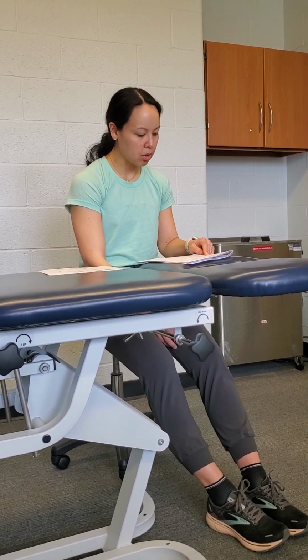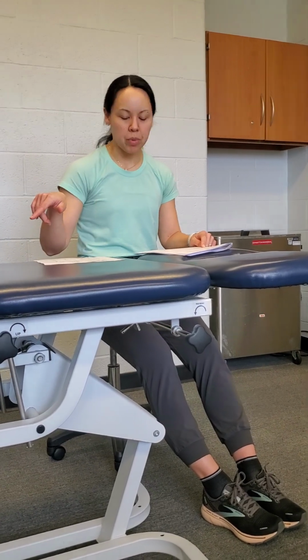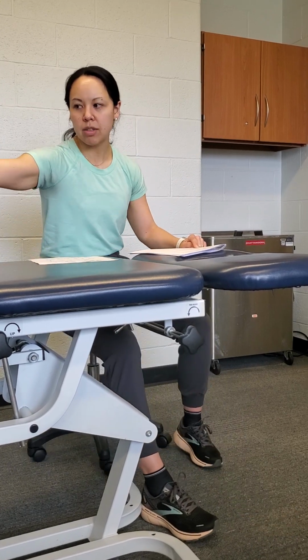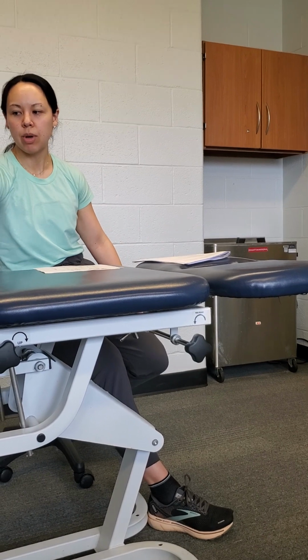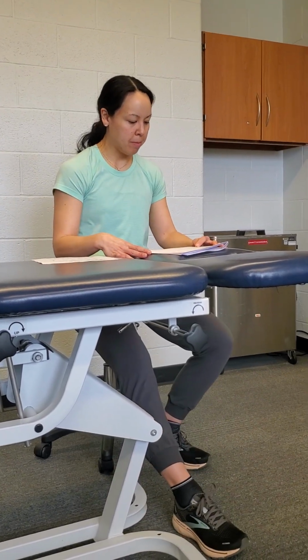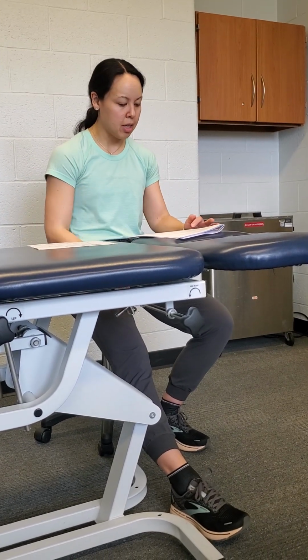So basics, setting up your patient. We'll go over this when we get to the lab session, so selecting the proper cuff. I was just telling them before you got here, red is going to be upper, unless you have someone with a really big arm, then you might go to blue, and then blue and green are going to be more for lower extremity. Ensure the Velcro has contact. I'll show you guys how to do that.